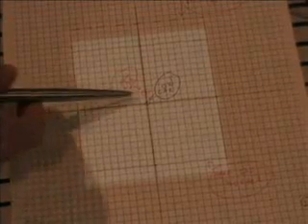Notice how the Y1 and the Y2 jaws, both of these, open up by 1 centimeter. If I want to keep this border where it is, all I have to do is move isocenter superiorly 1 centimeter. To make isocenter move superiorly, I have to move the table out. So I'm going to move the table out. We can see that I've kept my inferior border where it is, and I've properly opened up my superior border by 2 centimeters. This process is constantly occurring in a traditional simulation.